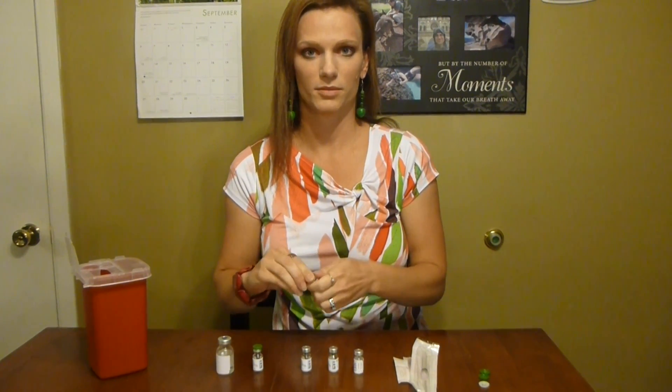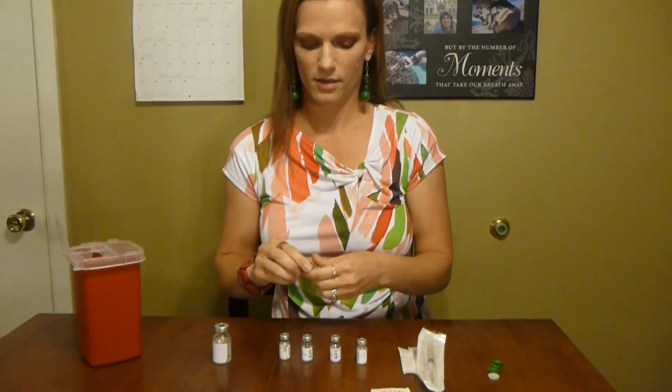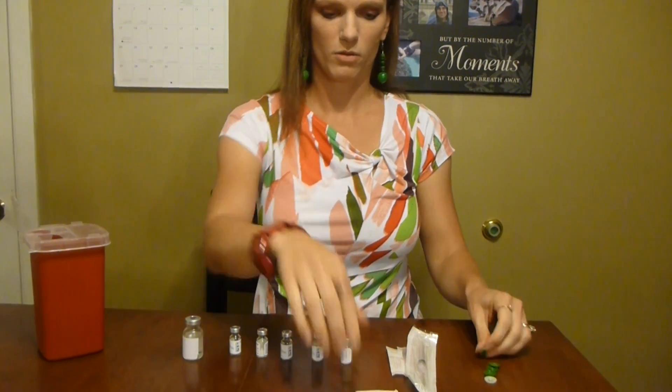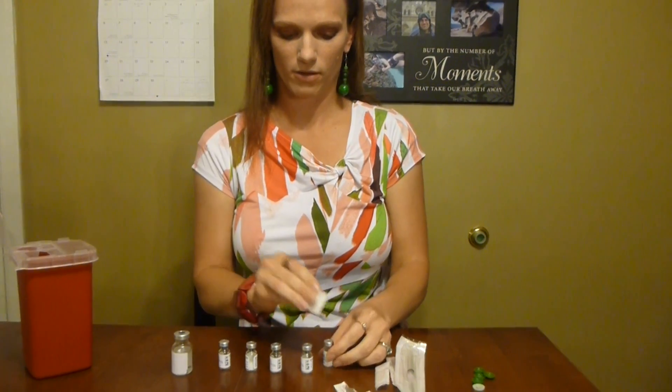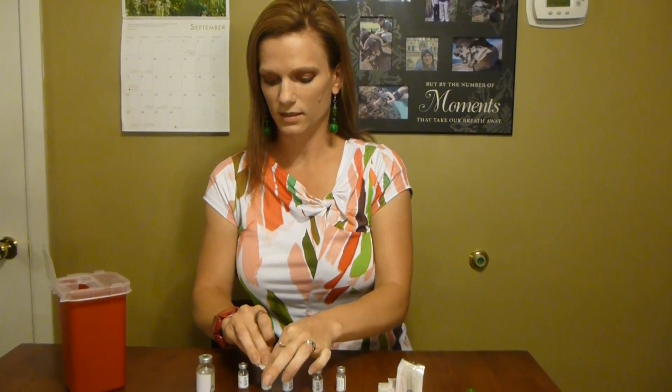So right now I'm just taking the tops off — it's all still sealed. That's the first thing I do, take the tops off. I'll go over what all of these are in just a minute. I just have to take one of these alcohol pads and make sure everything is nice and sterile.